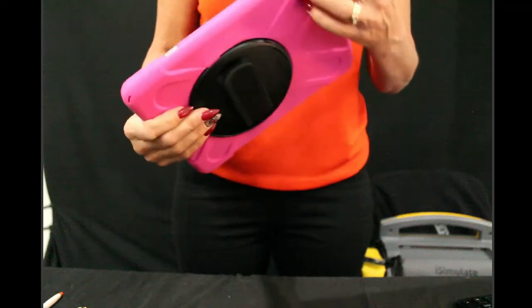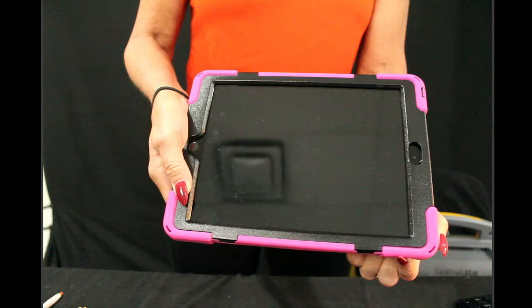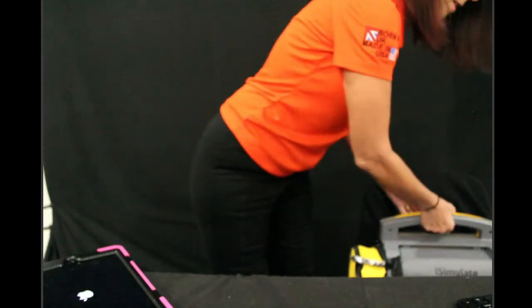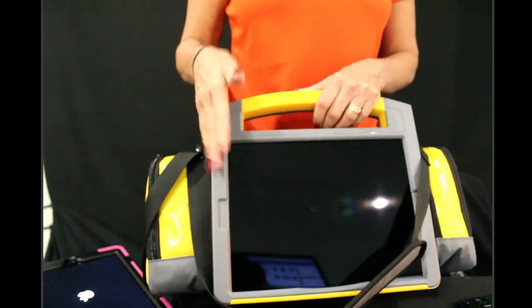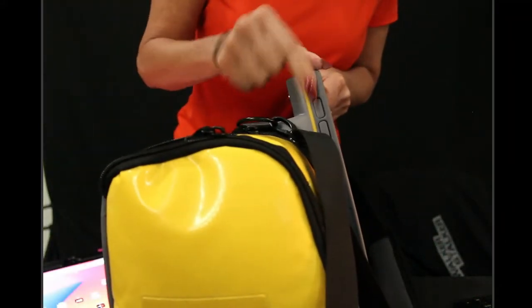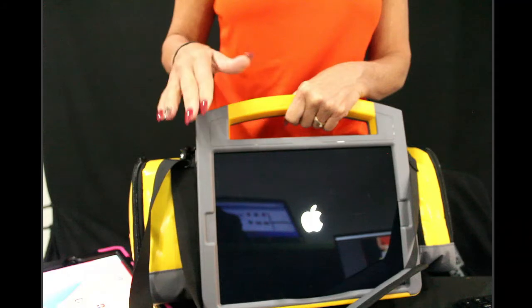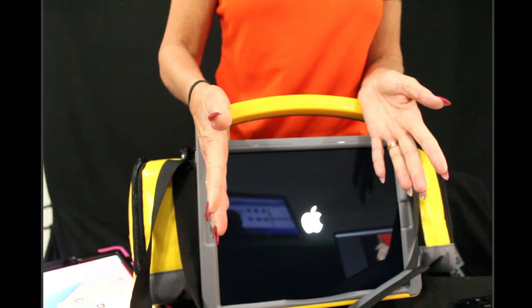To turn on the controller iPad, push the two buttons on the side and hold them down. You should see the Apple logo come up, and that's how you turn it on. To turn on the large monitor, there's a button on the right-hand side when the monitor is facing out. Just hold it down — it may be a little stiff at first because it's brand new and the plastic hasn't had any give yet — but hold on and you'll see the Apple sign appear, and you'll know you've turned on your monitor.